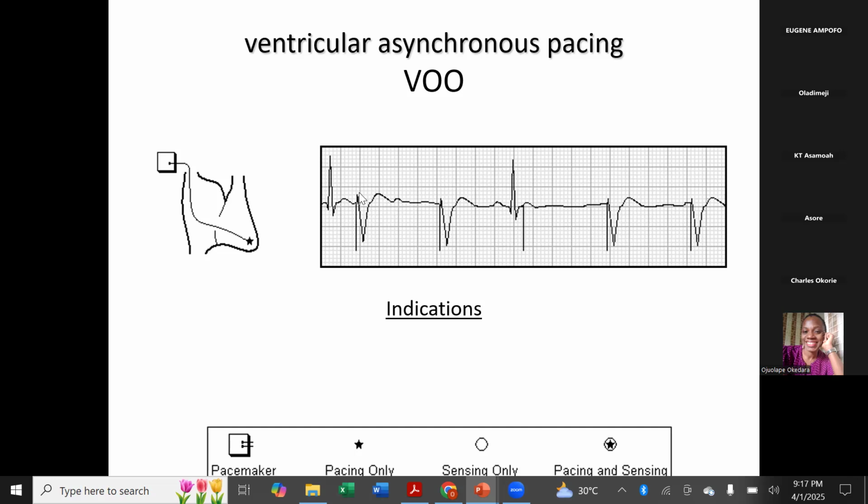And it continues to pace. So look at this next intrinsic activity here. Look at how close the pacemaker spike is to the intrinsic activity. Even though it is there, the myocardium did not depolarize following this pacemaker spike because it's still in the absolute refractory period. So that's why we didn't generate any proper action potential.